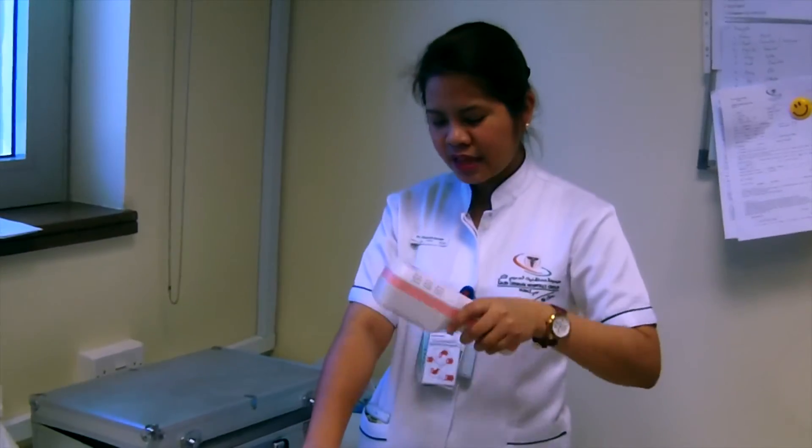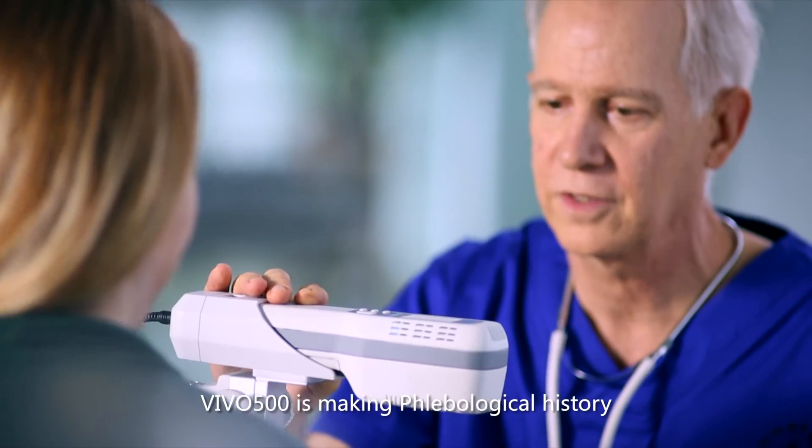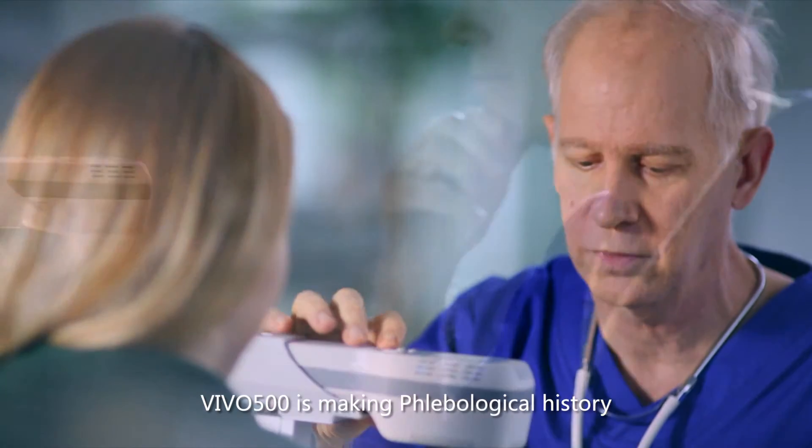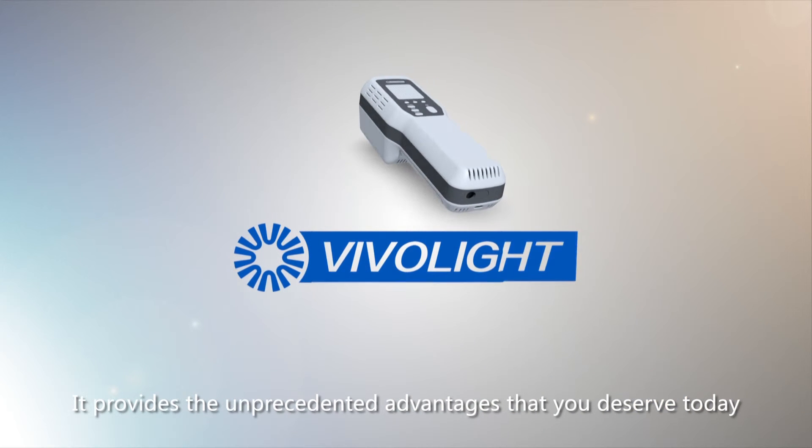It's good. It's handy and you can use it properly. We will buy this one. We use it in our hospital. VIVO 500 is making history. It provides unprecedented advantages that you deserve today.